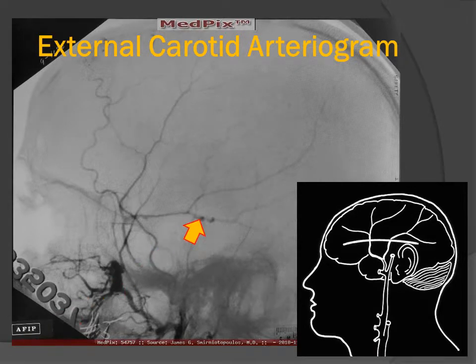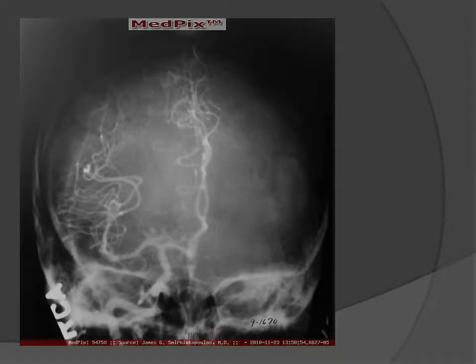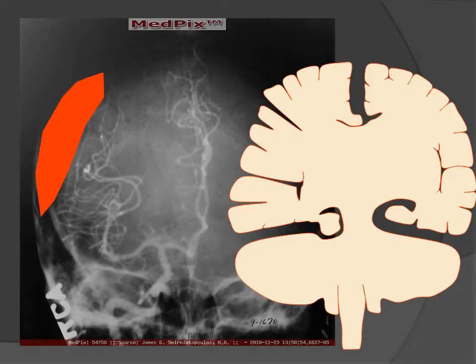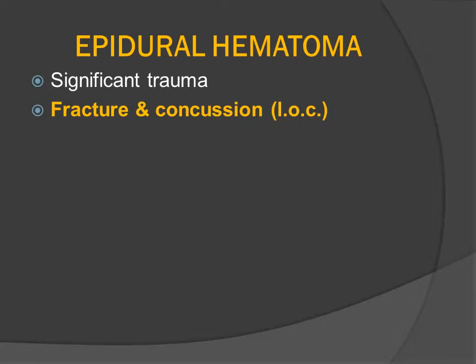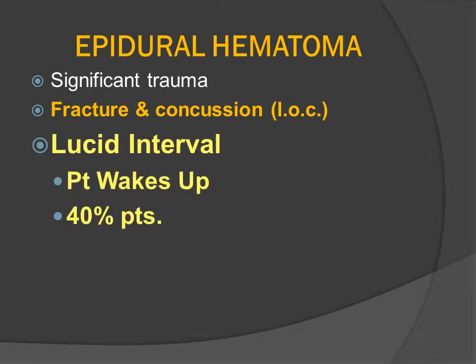In the lateral projection, we can see the extravasation of contrast material where the meningeal arteries have been lacerated as the fracture line has crossed the grooves holding these arteries. In the frontal projection in the same patient with the selective internal carotid injection, we can see how the brain is being displaced away from the inner table of the skull, producing the translation of the brain and the tentorial herniation.